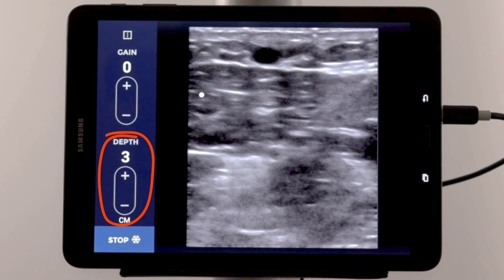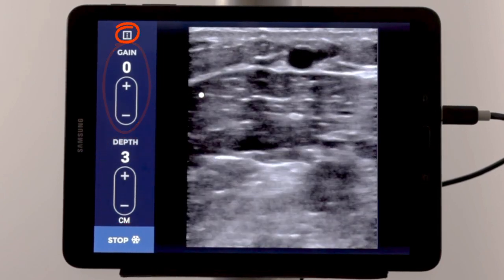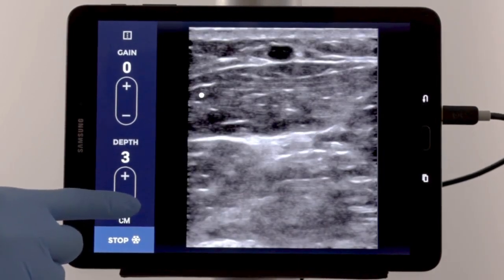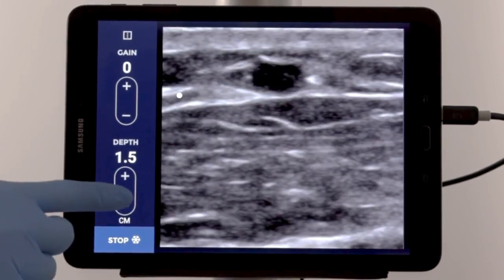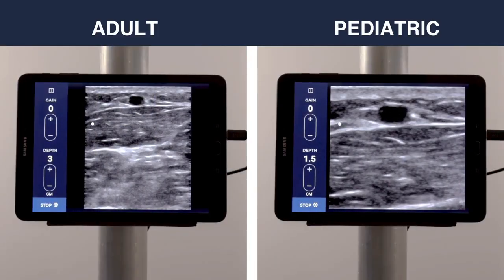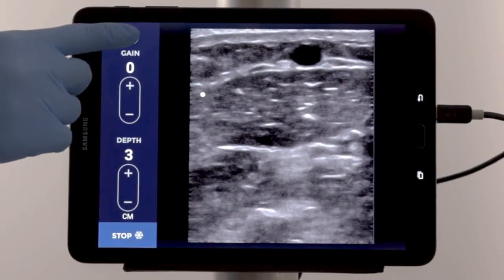From the control panel, you can adjust the depth and gain, as well as turn on the center depth markers. The depth settings range from as deep as 5 cm to as shallow as 1 cm. The system defaults to 3 cm in Adult mode and 1.5 cm in Pediatric. To display the center depth markers, tap the center guide icon.